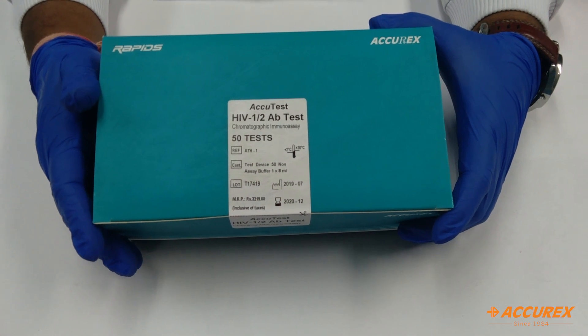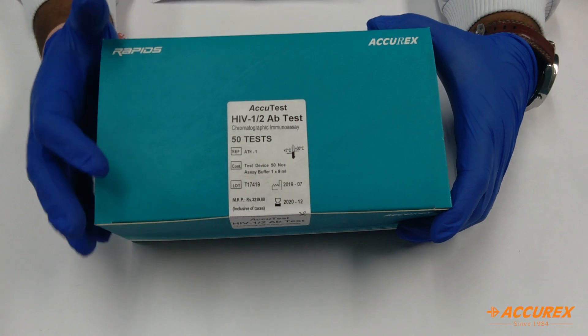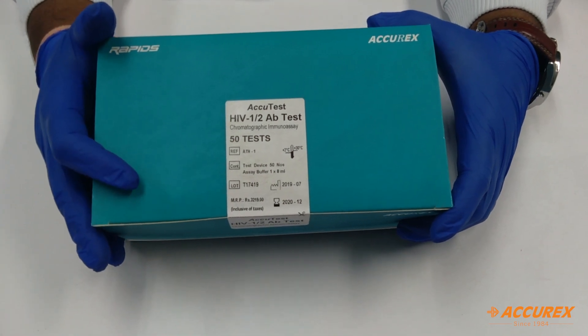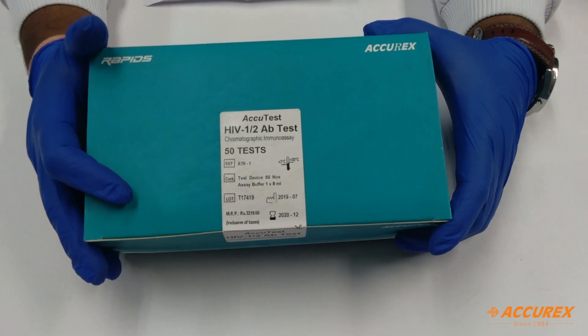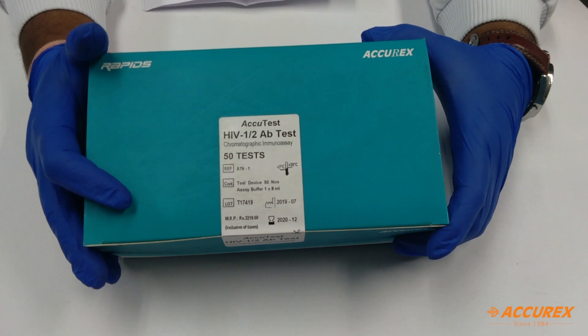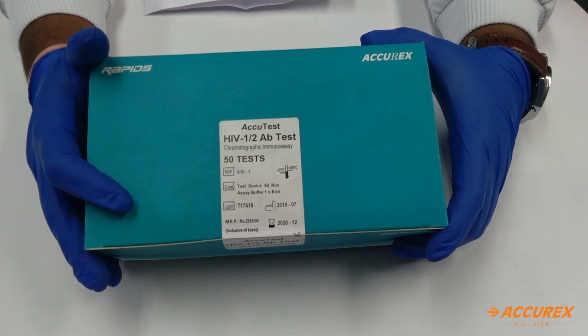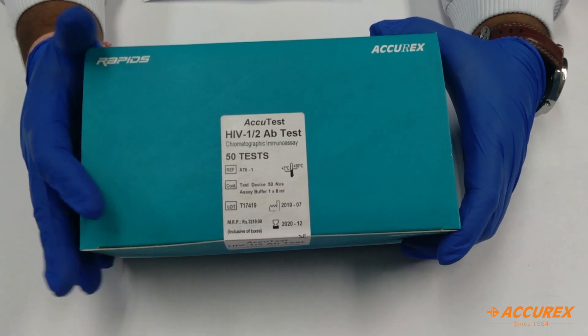Hello everyone, welcome to Aqurex YouTube channel. Today we have brought a product called HIV-1, 2 antibody test. This product is an immunochromatography assay for the qualitative in vitro diagnostic detection of antibodies to HIV-1 and 2 in serum or plasma. The product may be used as an aid for the detection of HIV infections.